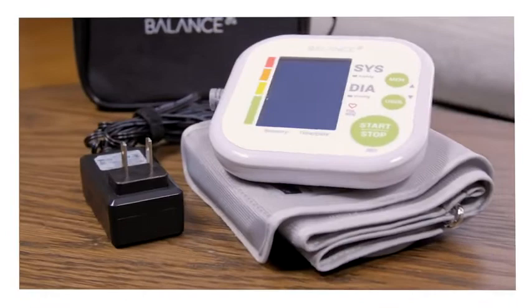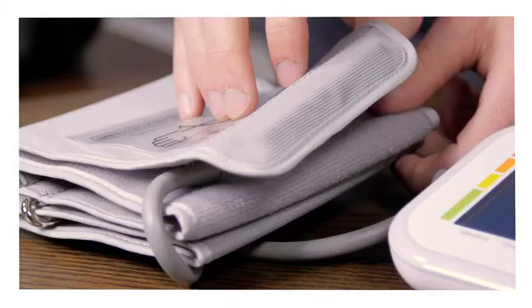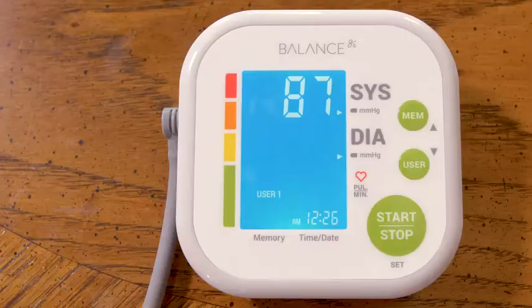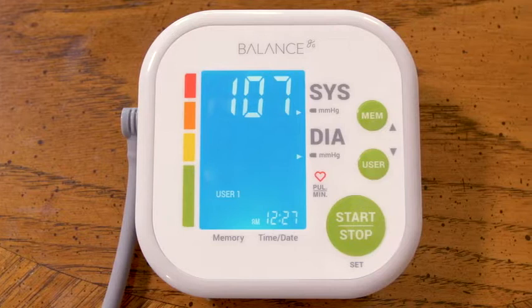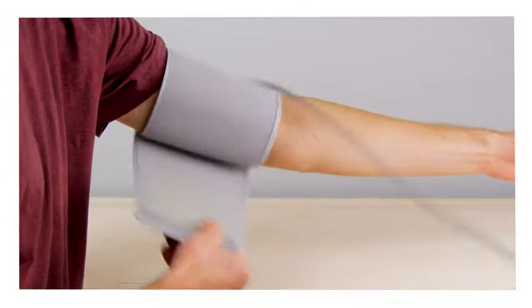You've got your monitor, of course, which has a built-in pump. You have the wall adapter so you can use power whenever you're at home and plug into the wall. And you've got a very sturdy cuff. AAA batteries are right there in the case so you can get started right away. The numbers are going to be very bright, very large, easy to read right here on the LCD display.